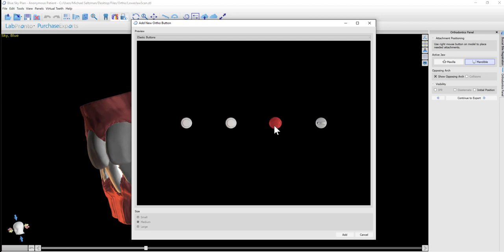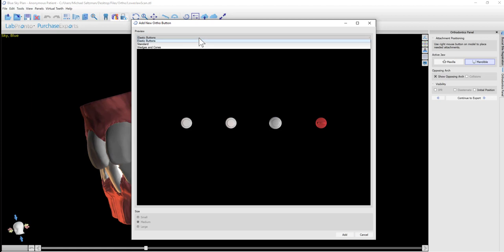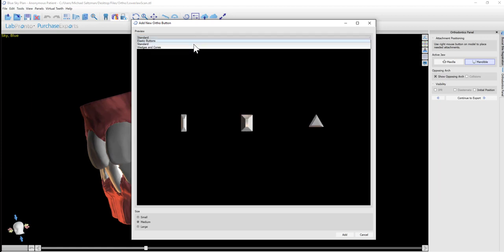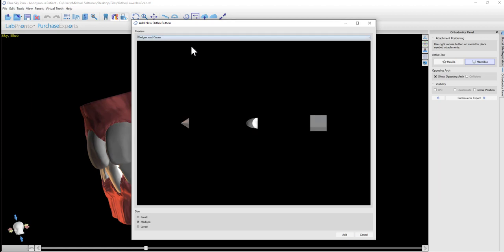You'll be able to select the button that you want to add, or you could check the different libraries that we have to see the different shapes. Select the size: small, medium, or large, and then click on the Add button.